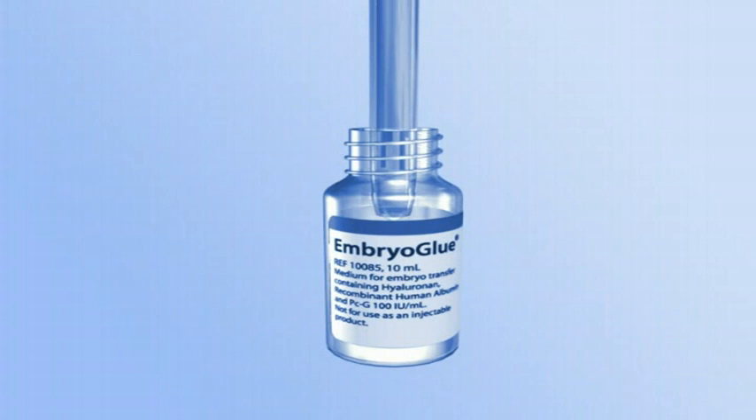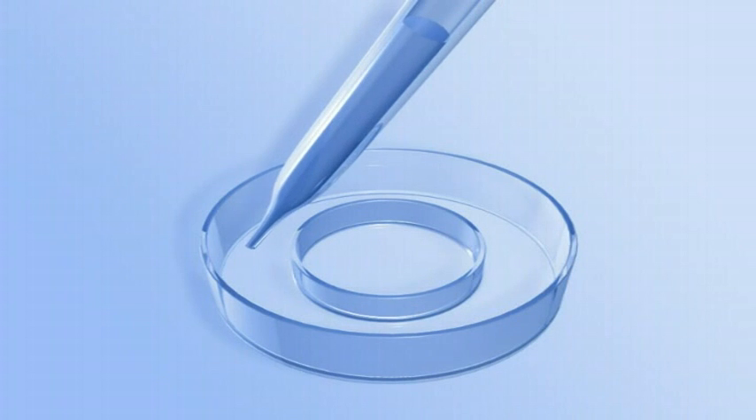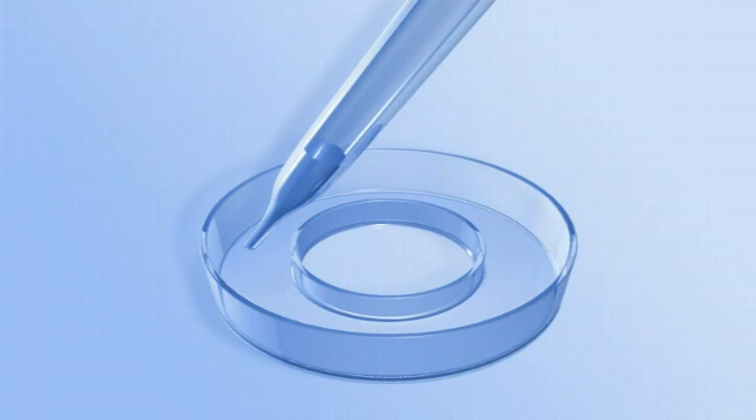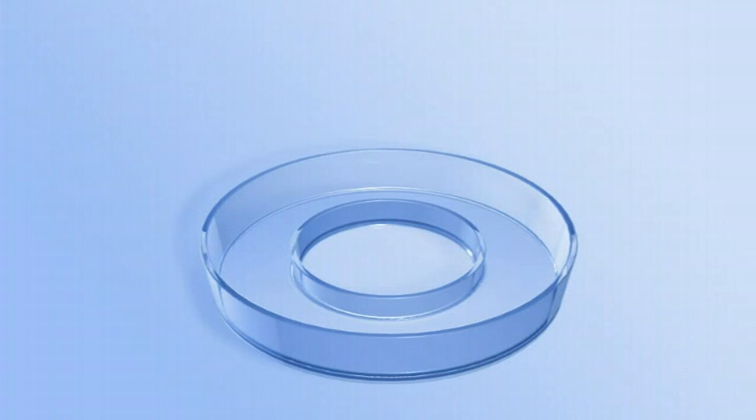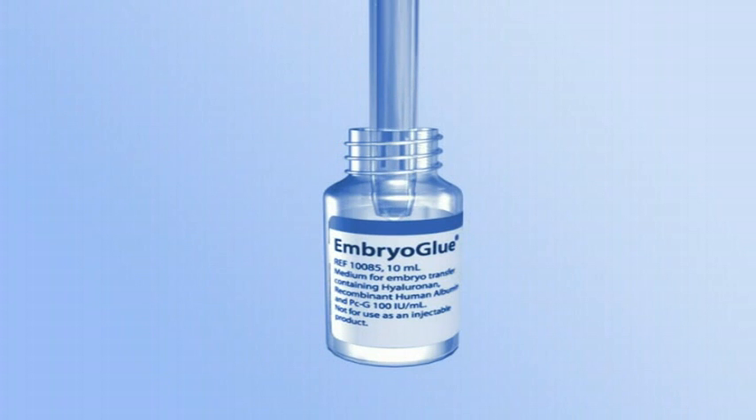Pipette approximately one milliliter of embryo glue and add to the moat of the transfer dish. Pipette another one milliliter of embryo glue and add to the well.